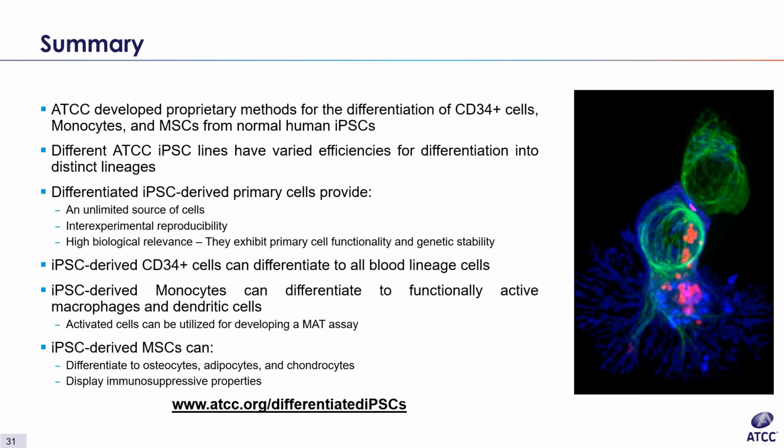All right, and I'm going to keep going until I hear Kevin pipe in. What is the optimal cell confluence when passaging MSCs? So 85 to 90% confluence is optimum. Do not go beyond 95%, or you'll see a rapid drop off in the cell's differentiation performance. Okay.